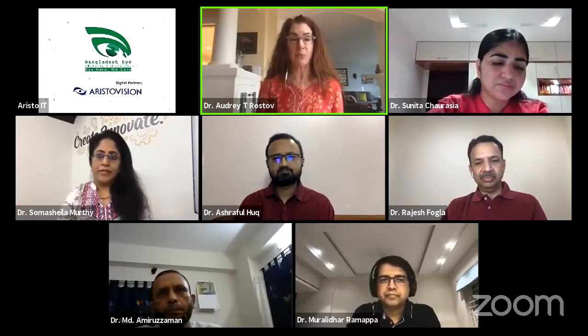I'm not really that worried about cataract formation afterwards because a cataract is something that we can easily treat. In addition, if there is cataract formation, you can get a very nice refractive result doing cataract surgery following PK or DALK, and really help the patient achieve excellent vision. Here, I usually use a toric lens with additional corneal relaxing incisions. You can also just do corneal relaxing incisions to help manage any astigmatism about a year out.